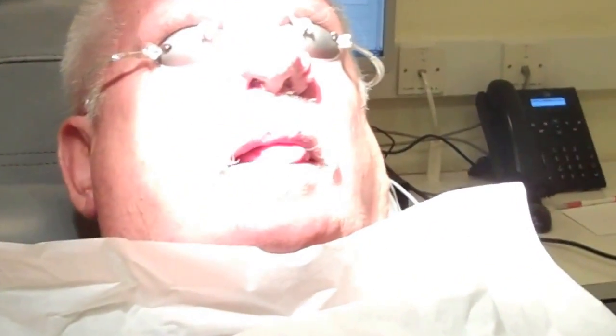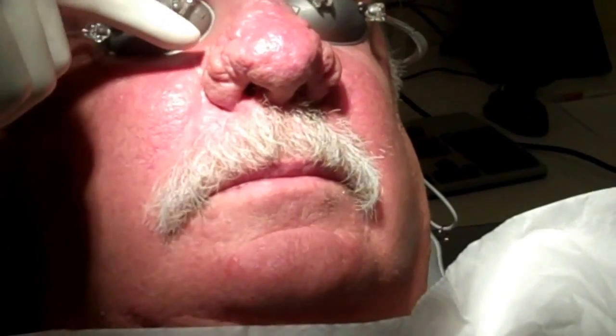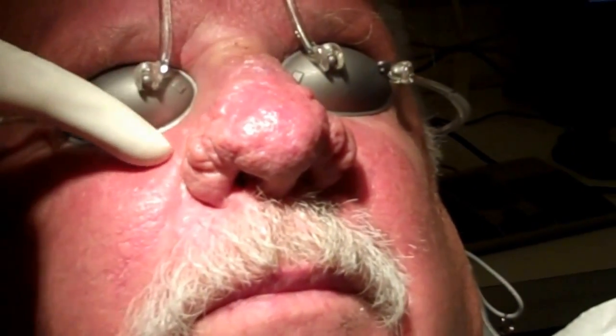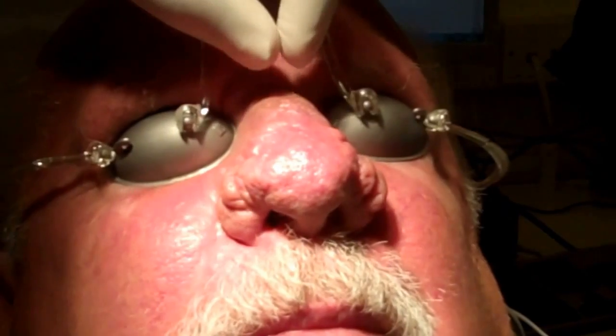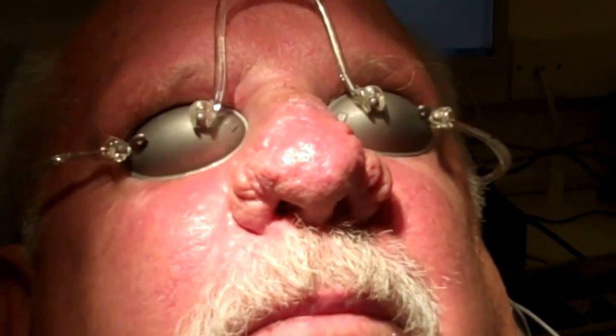Today we are doing laser resurfacing for severe rhinophyma. Here's a gentleman who's had the rhinophyma for some time. Before we start the laser procedure, he's had three local anesthetic injections — at the root of the nose and on either side of the nose-cheek junction — to anesthetize the infraorbital and infratrochlear nerves. So the nose is pretty much numb. We will now test the laser, and I'm using the KLS Martin CO2 laser.